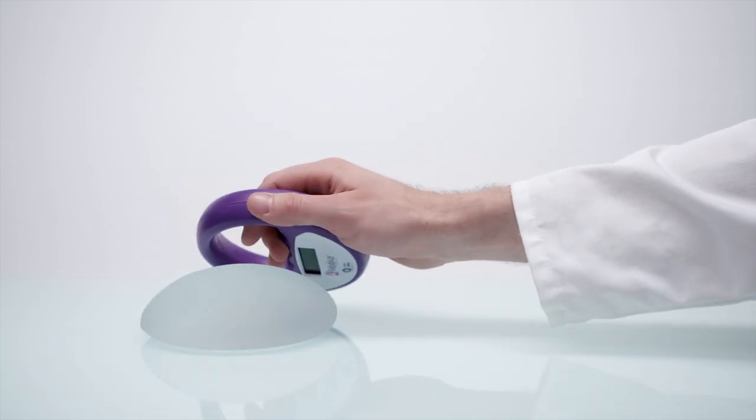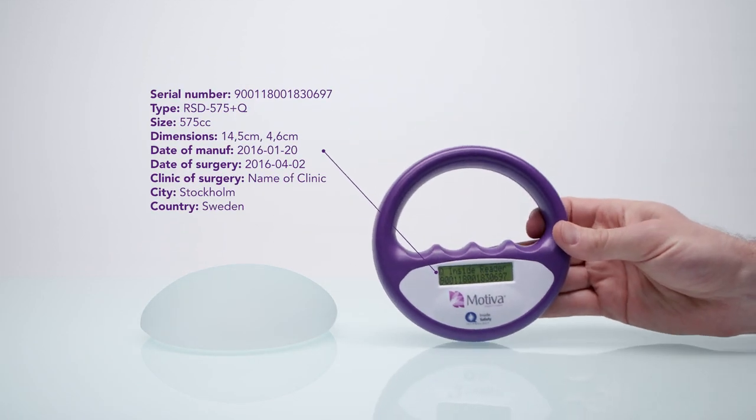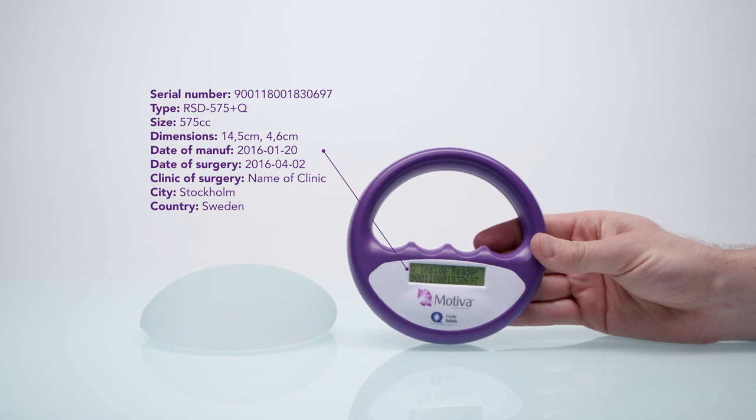Motiva's general warranty covers implant rupture for the entire lifetime of the implant. It also covers a type of capsular contracture specified as Baker Grade 3 and 4 for 10 years. Should any of these complications occur, the implant is replaced free of charge.